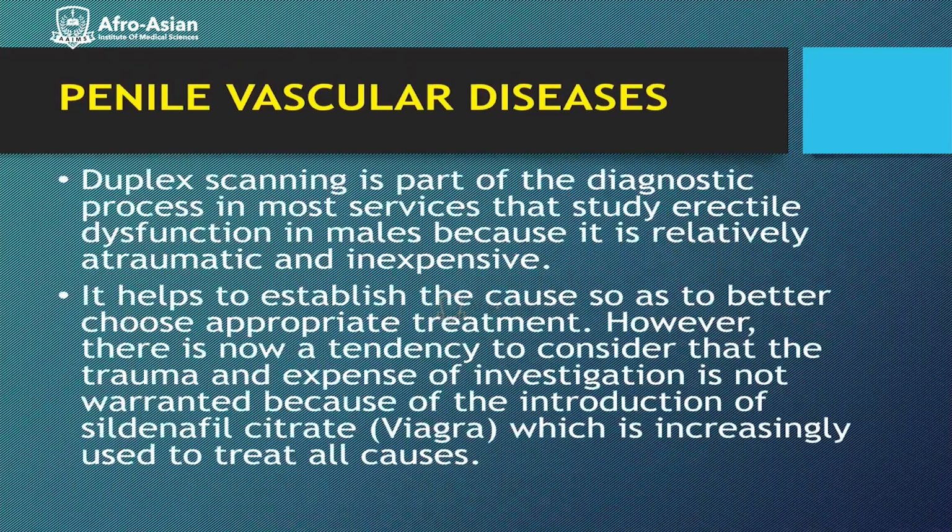For penile vascular diseases, Doppler scanning, which is the color Doppler scanning, is part of the diagnostic process in most services that study erectile dysfunction in males because it is relatively atraumatic and inexpensive. It helps to establish the cause so as to better choose appropriate treatment.